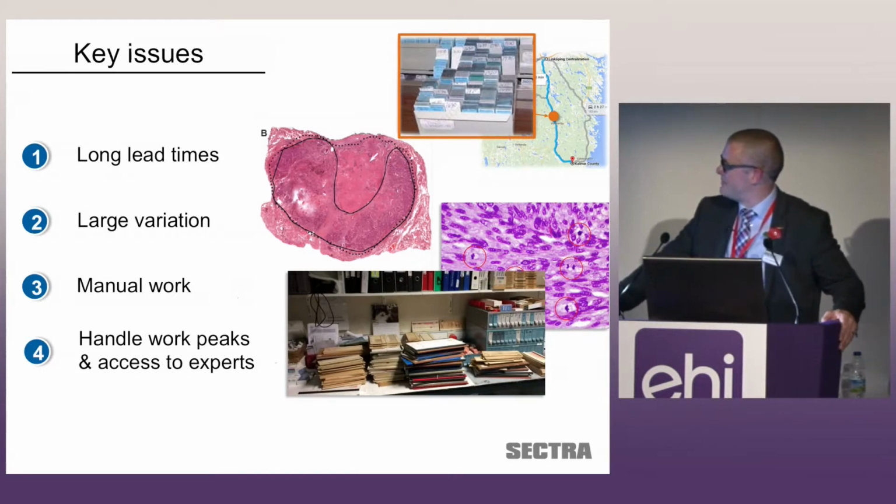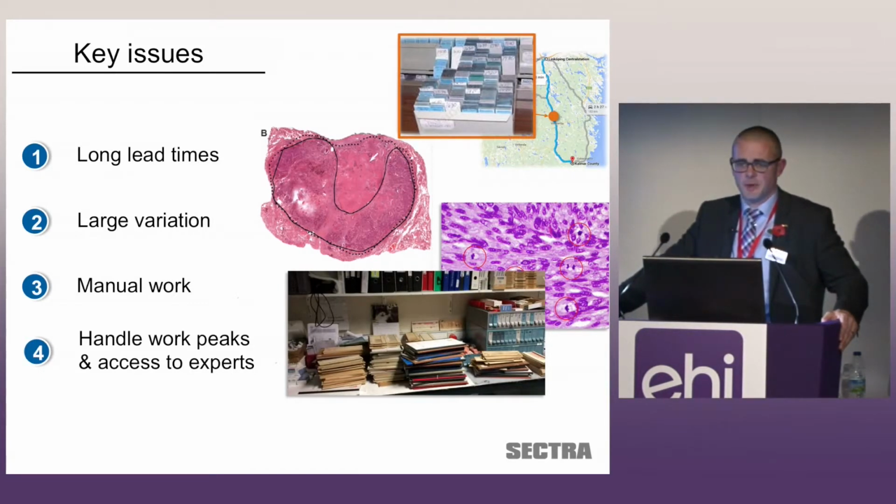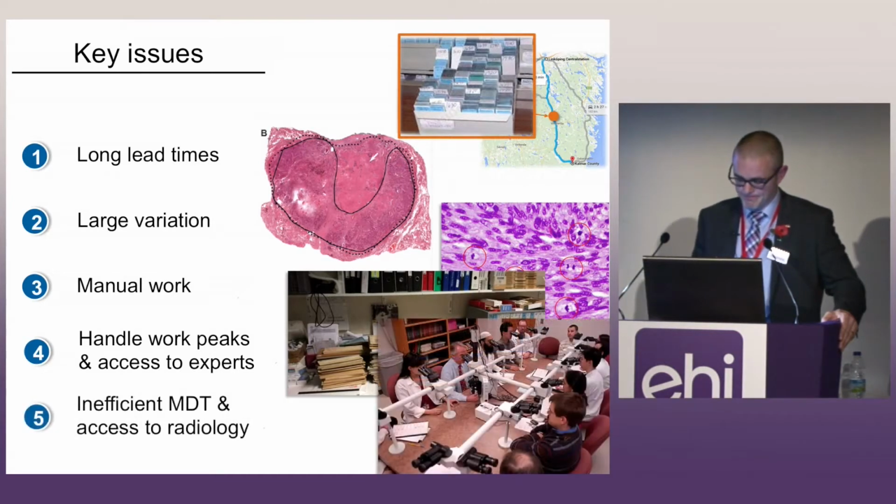This is a typical representation of a pathologist's desk when he or she comes into work on a Monday morning. That is a pretty average caseload, and a pathologist will need to manually take out the slides from each of those packets, place them on the microscope, and report each and every one of them. You can imagine how inefficient and difficult that workflow can be to handle.